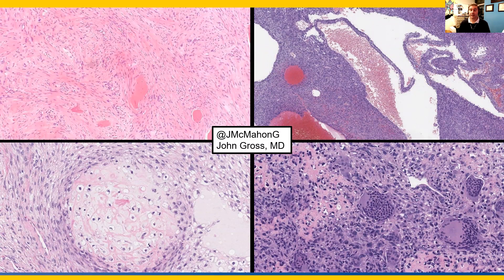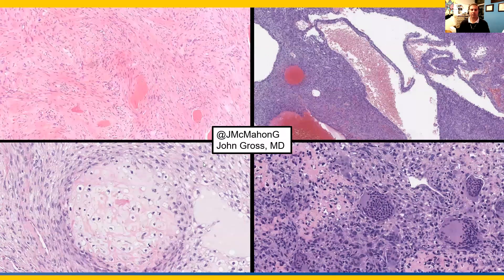The top right is telangiectatic osteosarcoma — what we are currently dealing with in our patient. Blood-filled cystic spaces; various areas are a little bit more solid and cystic. The amount of osteoid production can be quite focal, which is often why you will need to correlate with the radiographic features. The bottom left shows a focus of chondroblastic osteosarcoma surrounded by a more fibroblastic component. And the bottom right shows giant cell-rich osteosarcoma, with malignant cells producing mineralized osteoid and scattered abundant osteoclast-like giant cells.